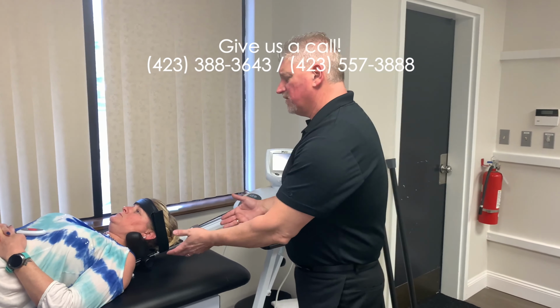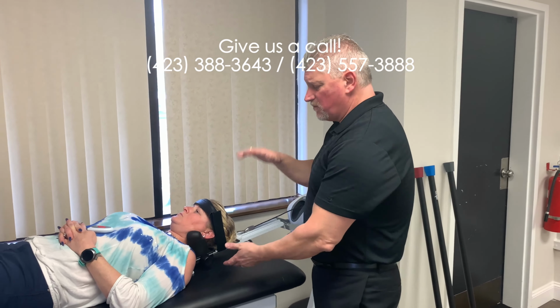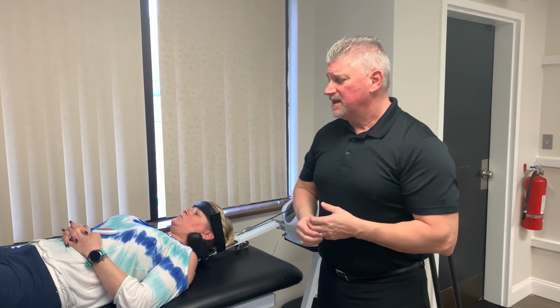So depending on our angle is depending on what disc level that we think it is. C7, C6, 5, 4, 3. Depending on where that disc angle is, we're going to raise or lower the table to get a different angle. And then we're going to have different weight settings, so it's going to intermittently pull, hold, and release. And this combination is going to help us differentiate, do I have a disc or don't I? And it's also going to help me determine what level it is, again, based on our history, our examination, and our assessment.